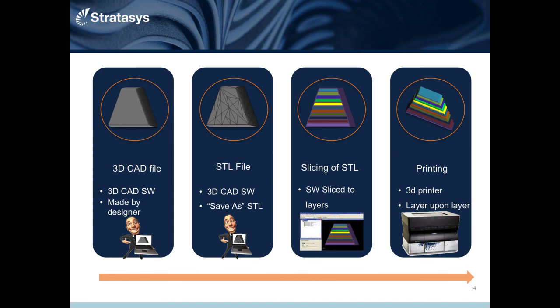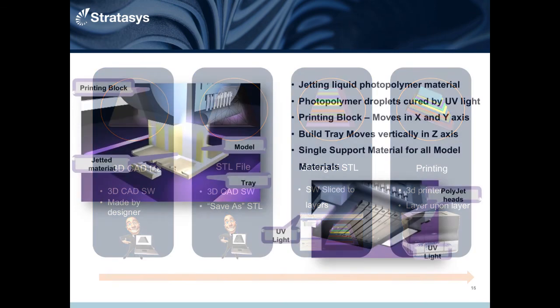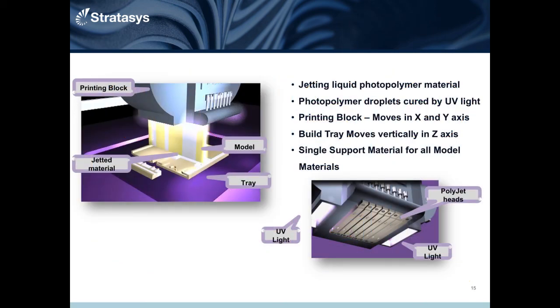So all of this 3D printing, all the STL files, these are all achieved through third-party software. Cody gave a demonstration of a couple of the model builder software as a great example. So once your design is done, all we're going to do is slice it, and then we're going to print it. From there, it goes into our printer. Our printer, from a technology standpoint, is very sophisticated, where it's actually jetting out a liquid polymer. Once this polymer is jetted out, it's instantly cured with a UV light.